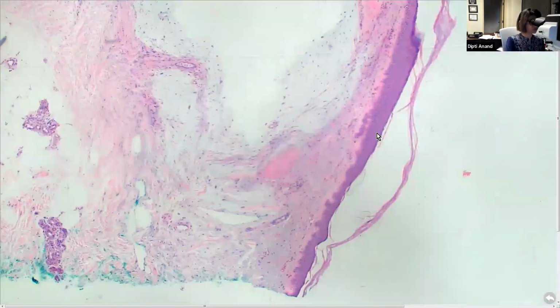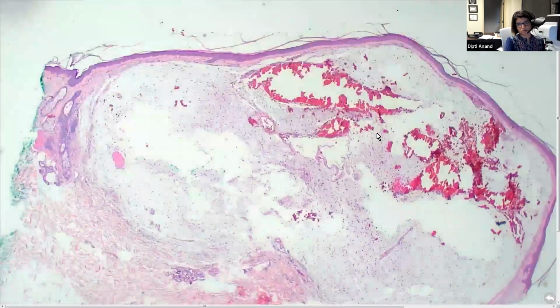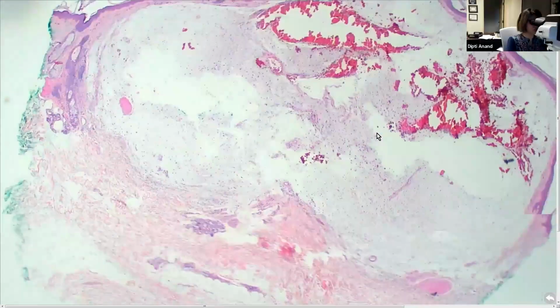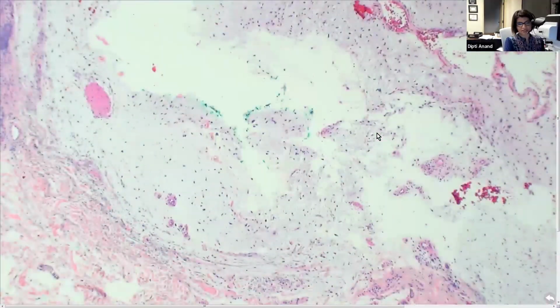Good. Okay, and we have your slide number 4. So what's happening in here? There's lots of mucin. Solitary lesion, it's a hemorrhage. So like a myxoma, or focal cutaneous mucinosis. Yes, the hemorrhage is from the biopsy, but you can see lots of mucin in the slide. It's forming a solitary lesion, so that will be focal cutaneous mucinosis or myxoma. Good. And you have your slide number 5.